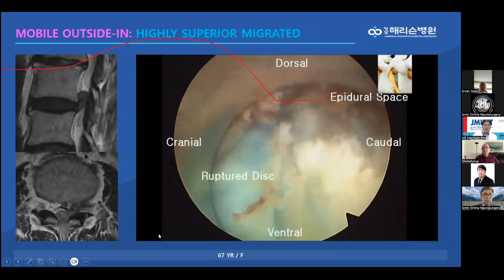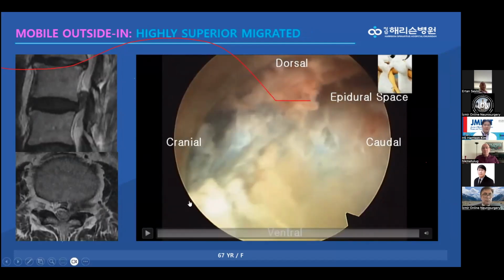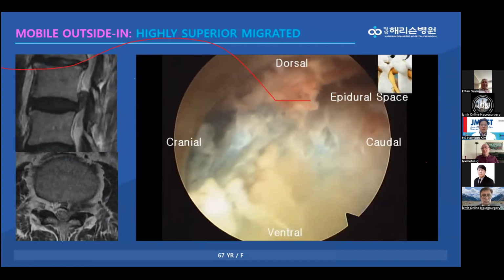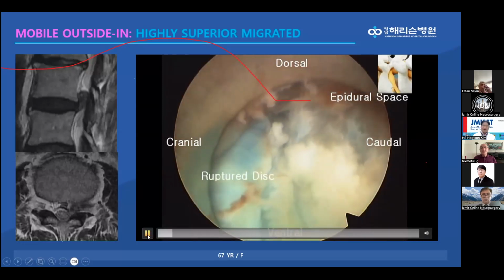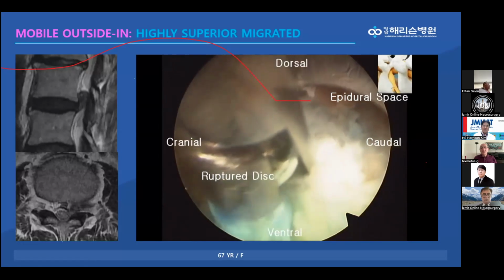Before we see some intervertebral approaches, now we will see the foraminal root approach. Here you should check two points. One point is how to protect the exiting nerve root, and the second point is how to approach the target point. I already mentioned using working channel rotation, changing the angle, and the vertebral overriding technique. Firstly, protect the dorsal root ganglion here, the ruptured disc.